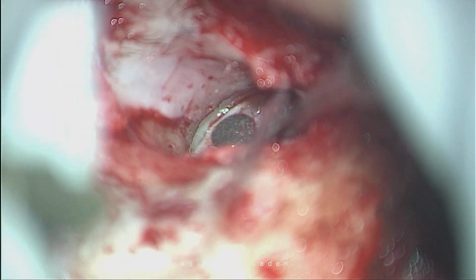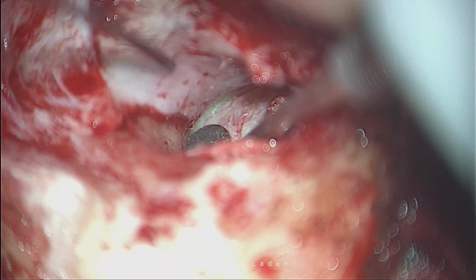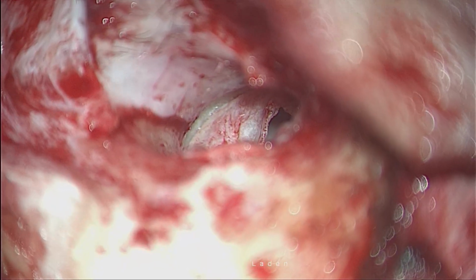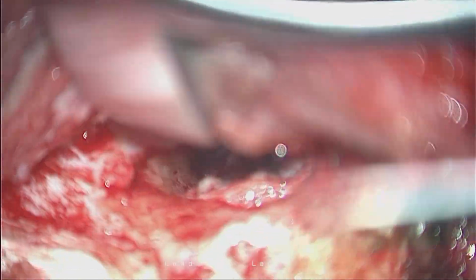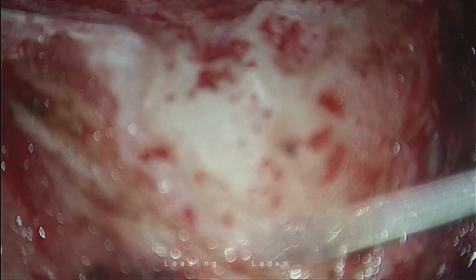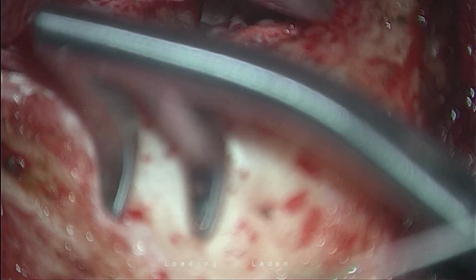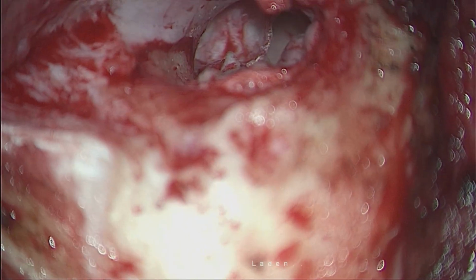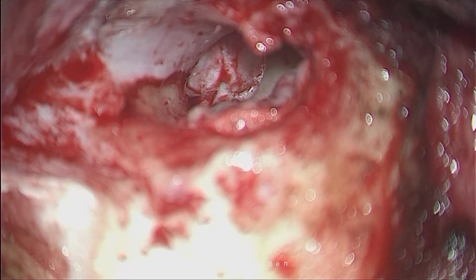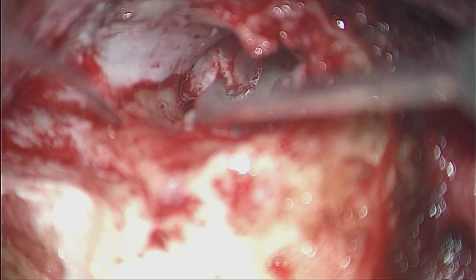Sometimes you find a sharp ligament over here. Many a time we call it the Ashim Desai ligament, who has described this ligament many a time. Why is this important to discuss? Because that ligament, if you try to elevate it with your blunt instrument, can result in tears in the flap. So you have to be careful and cut it sharp. Ashim always emphasizes it, and I call it the Ashim Desai ligament.